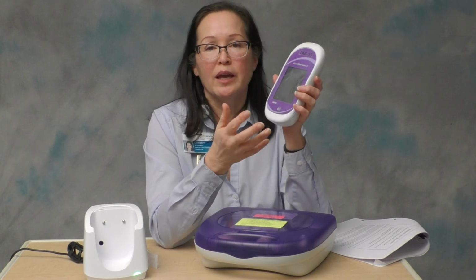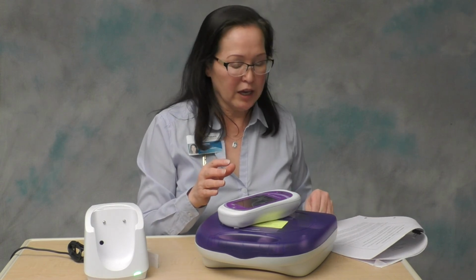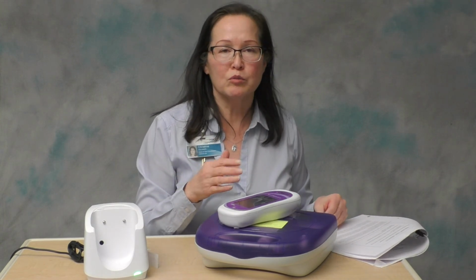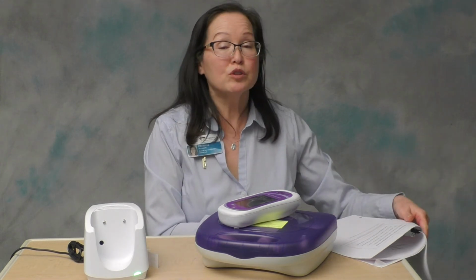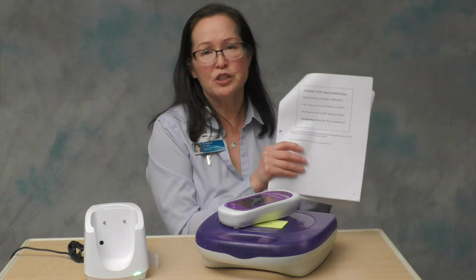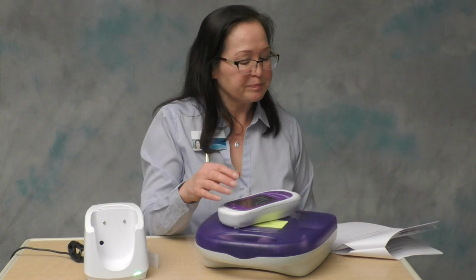The other comments are merely communicative, so they can communicate maybe to somebody that's coming on shift after you or to the provider. They include things like use this result, or will order lab, or patient was symptomatic. The other comments will show up in Epic. Procedure error comment does not show up in Epic, it just keeps the result out of Epic.